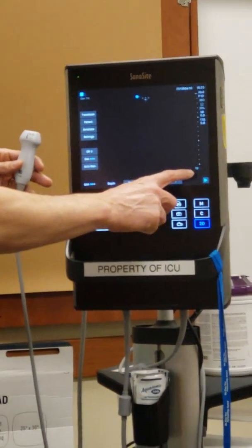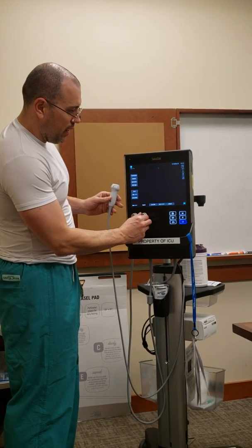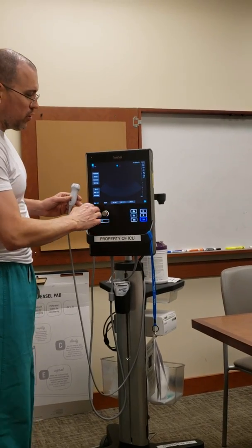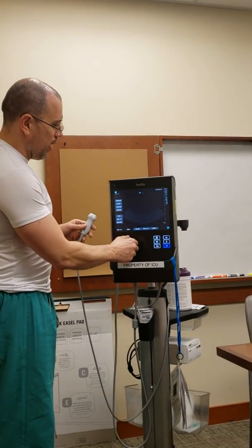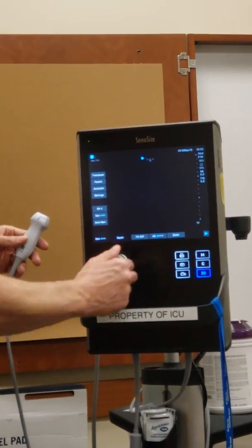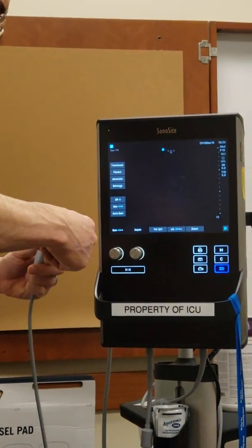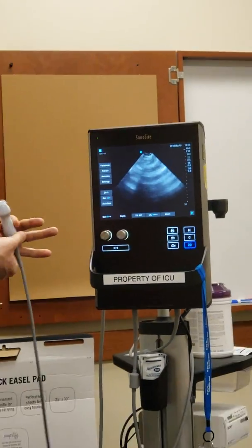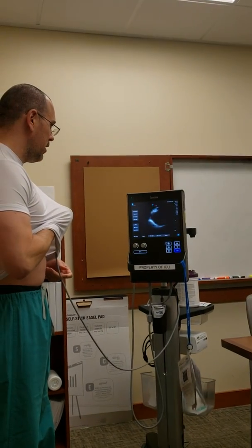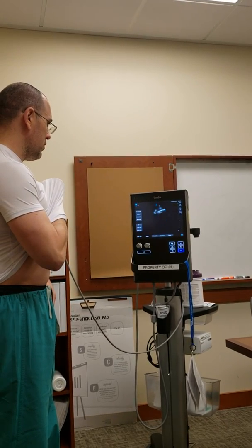One of the things you'll notice right away is that the depth is now at 16 centimeters. If I change my depth button, I can go all the way out to 35 centimeters — that's because it's a low-frequency probe. But commonly we start our exams at 16 centimeters. To give you an idea of what this probe is for and why you want that 16-centimeter depth, let me try to do a cardiac exam on myself, which is rather interesting.